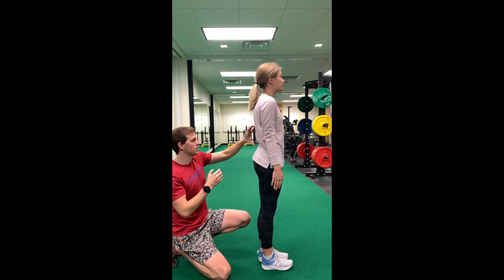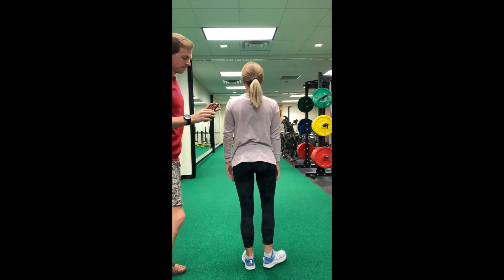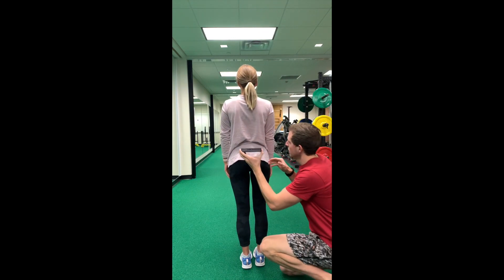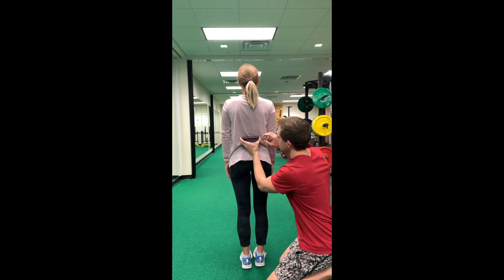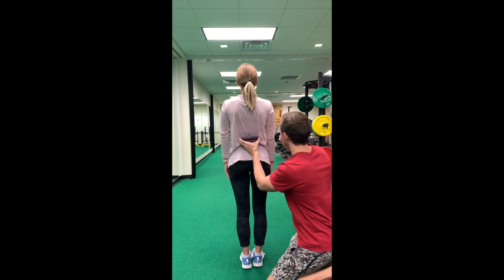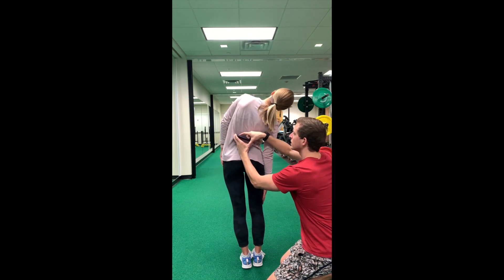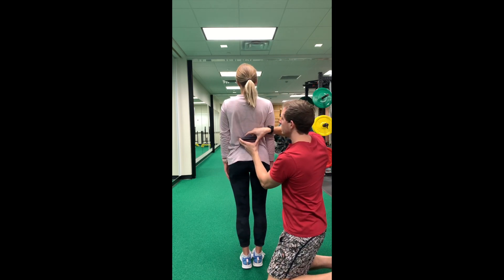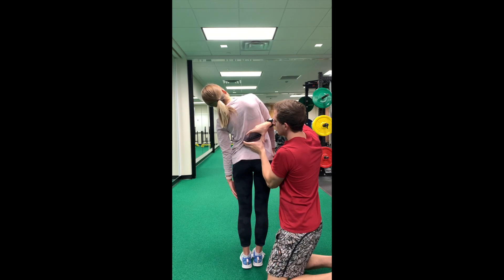Now for side bend, have the patient rotate this way. Place the phone horizontally at the same landmarks, hit start, have the patient side bend to the right, and stop. Come back to center, hit start again, side bend to the left, and stop.